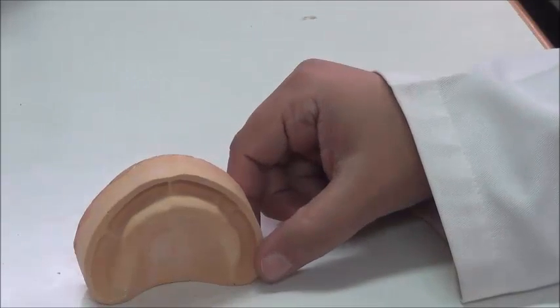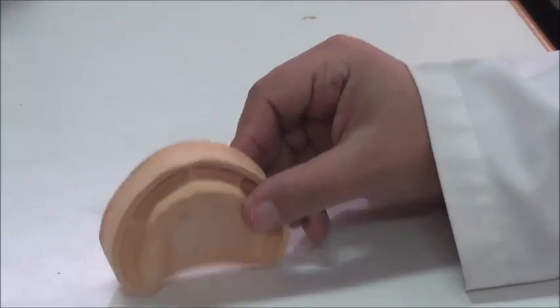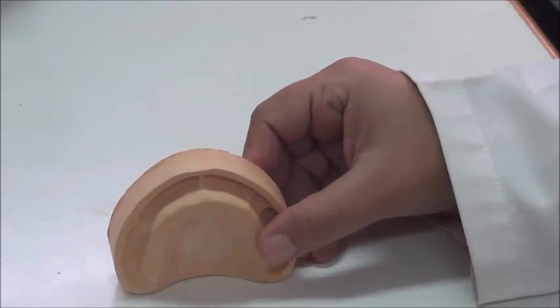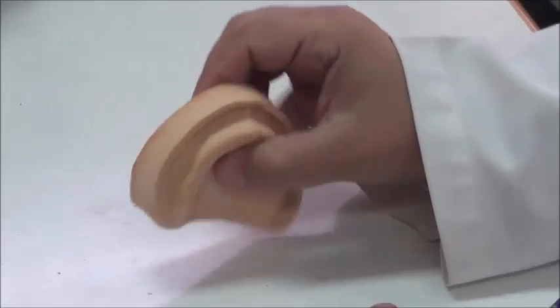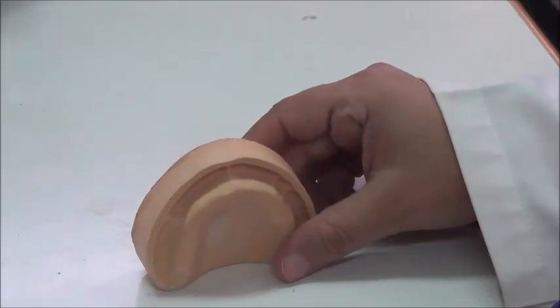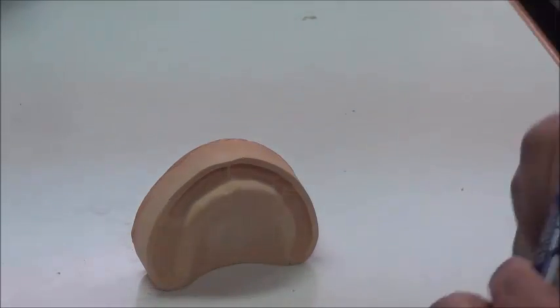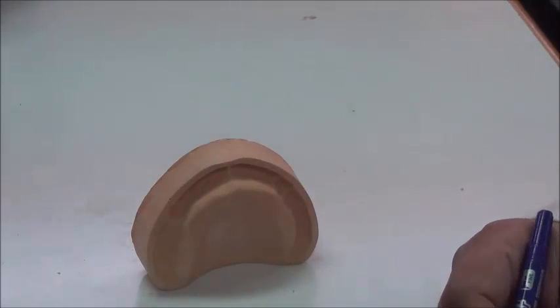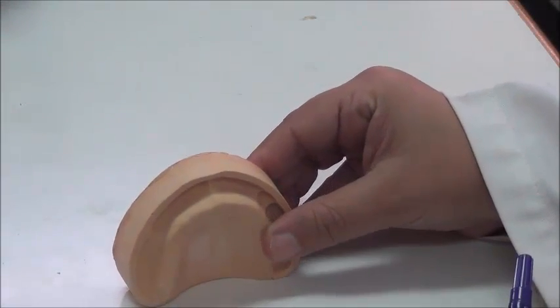If I take this cast and I want to make an orientation for it, I want to put it in the center, so I need to know the center of the cast itself. For the centering of the cast itself, I'll take an anterior point and I'll take 2 posterior points. So this is the procedure we're going to do. After you have finished taking the measurements and you have made sure that your wax rims are according to the quality that we have explained, you are going to work on the cast first, then we're going to put this all on the articulator.